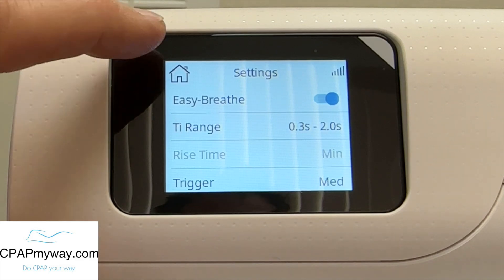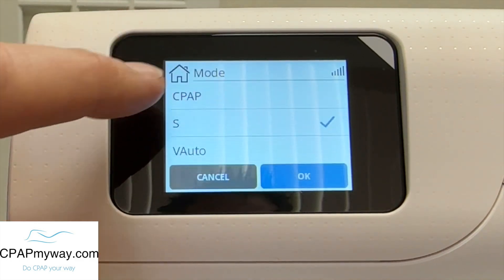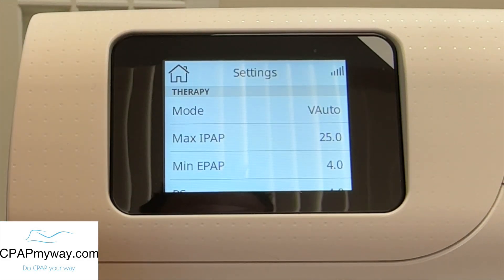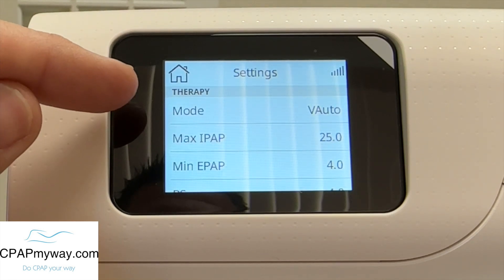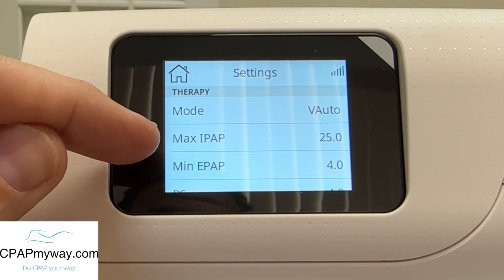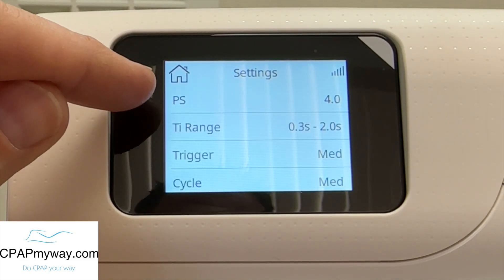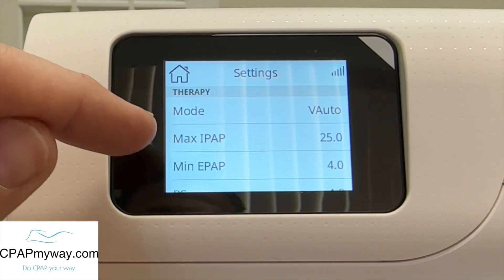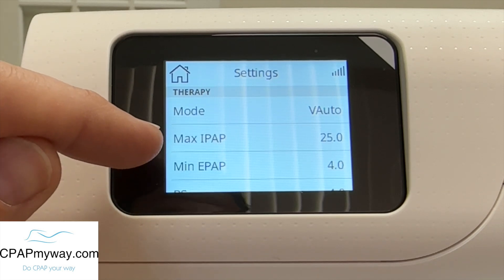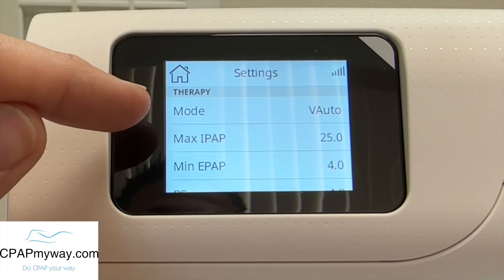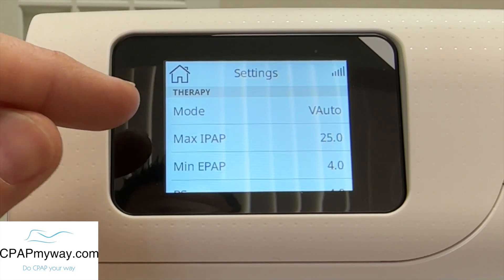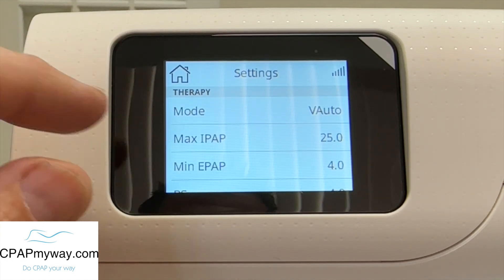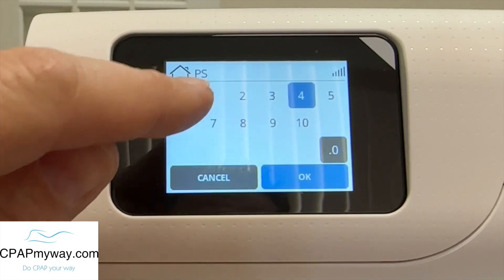The rest of the settings are the same in V-auto, so I'm actually going to jump back up to the mode and change it to V-auto. This is your auto bi-level mode — this is where you're actually going to set up a range. When it says mode V-auto, you're going to see max IPAP, min EPAP, then you've got pressure support. Pressure support is going to be the difference between your IPAP and EPAP. So while this is going to be a minimum exhalation pressure of four and a maximum inhalation pressure of 25, no matter where it is in that range, the IPAP and the EPAP will never be more than four centimeters apart at that setting.